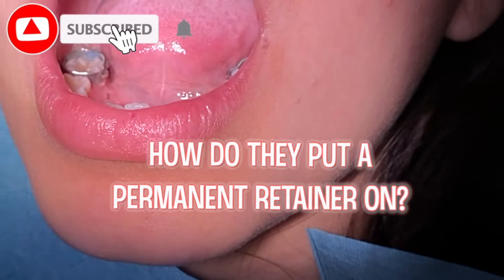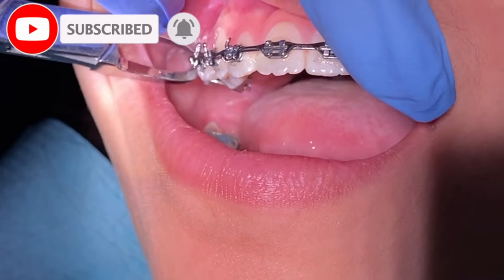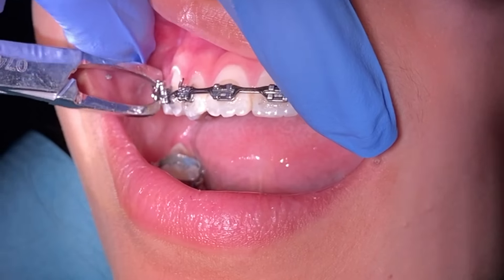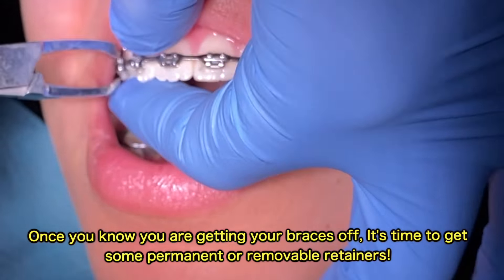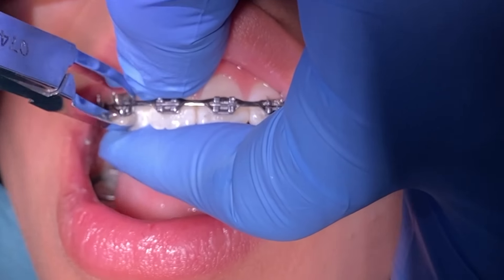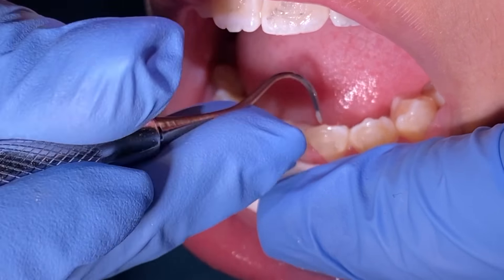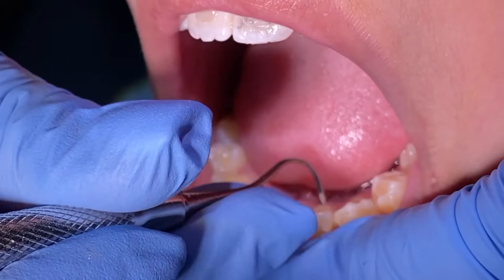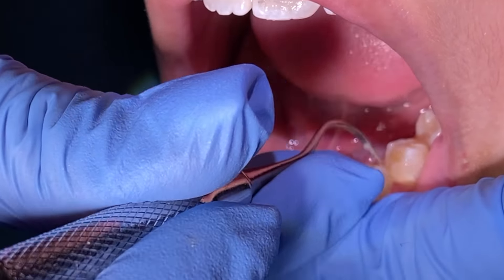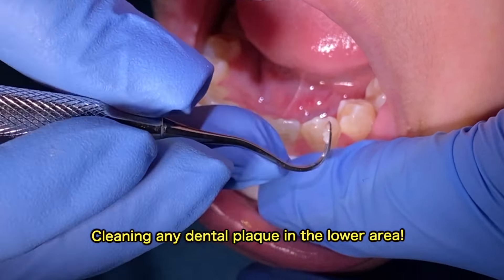Hey everyone, this is Abby, your hygienist that works in the ortho department. Today we're going to show you in our video how we bond a lower three-to-three retainer. One way to know that you're about to be done with your ortho treatment is whenever you get your lower three-to-three bonded before your braces are taken off, but there also are some occasions that you have your three-to-three bonded the day that you have your braces off.